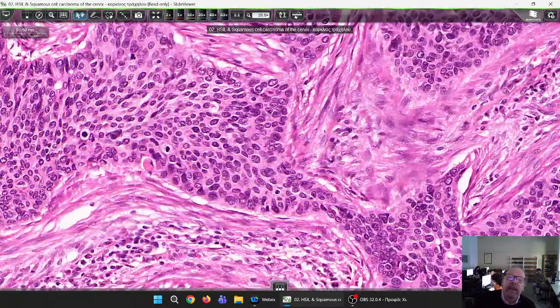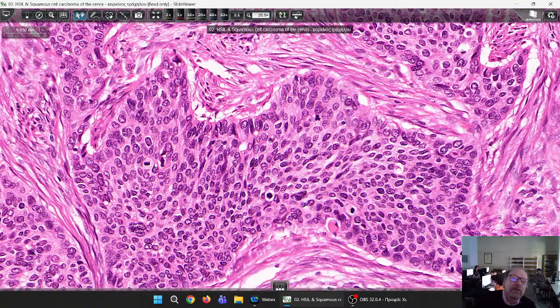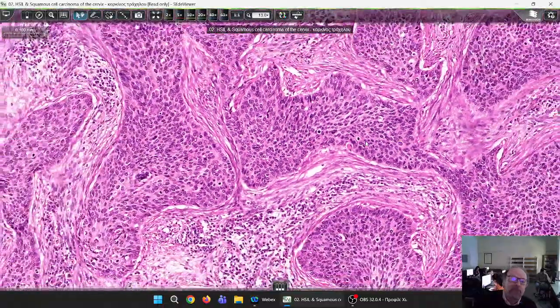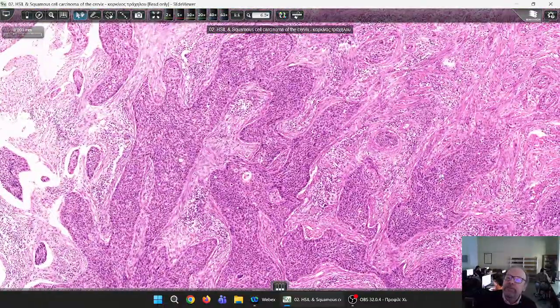That means high grade, because, okay, you can see all the mitotic activity. However, here, look, this may be dyskeratosis. That means apoptosis in single malignant squamous cells, which is evidence of some sort of keratinization, dyskeratosis.